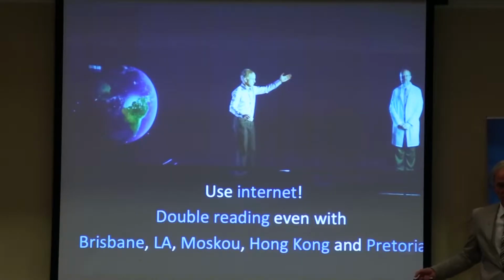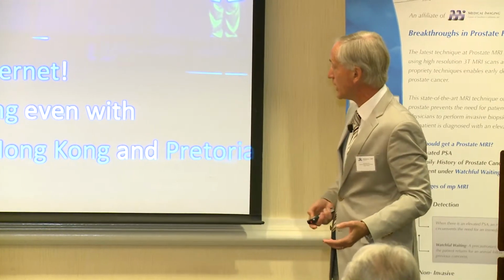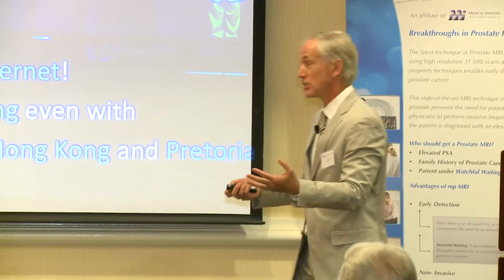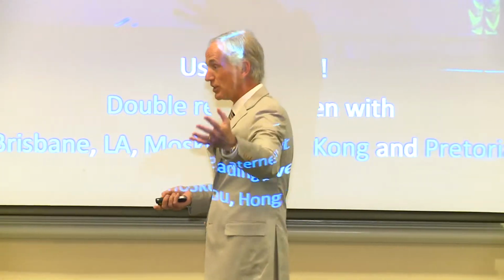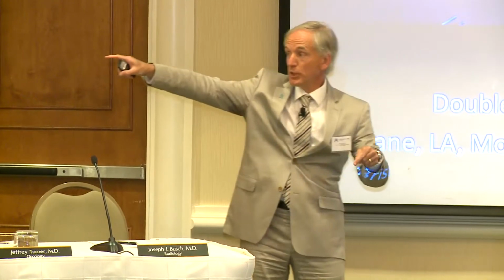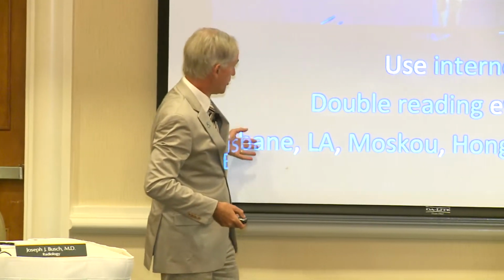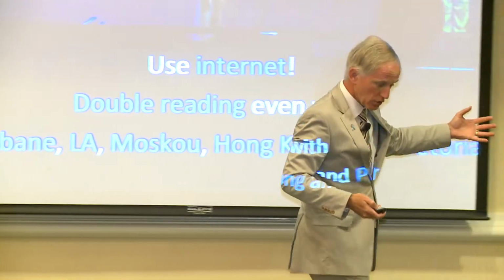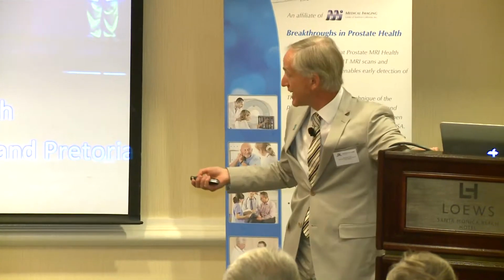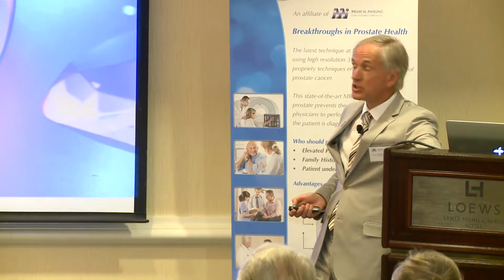We should use internet. Radiologists can communicate by internet. I can read images of this guy in Brisbane, Australia. We have now contact with Los Angeles. And Madeline is sending data from here to Nijmegen during the night. My guys put it into the computer, and I read it this morning from here to Nijmegen and back again. And I'm sending my report PDF file from Nijmegen to Brad while I'm sitting in the same room. Moscow, Brisbane, Hong Kong, Pretoria. Those are the areas in which we are now doing exactly the same as what we do here with Brad's team.